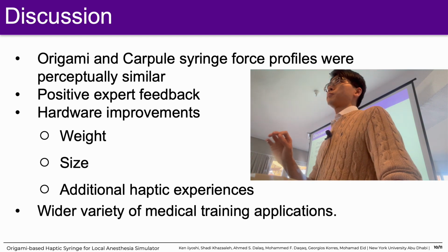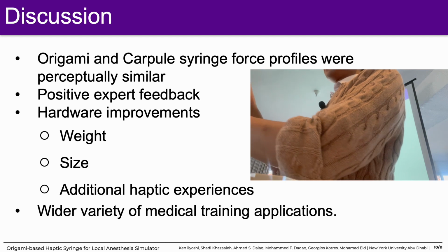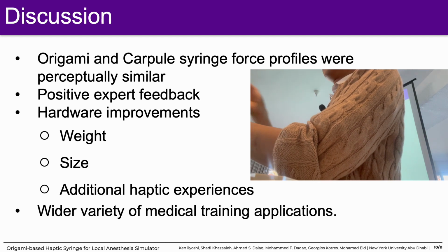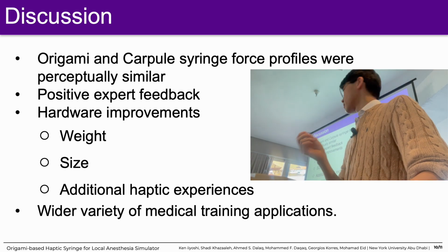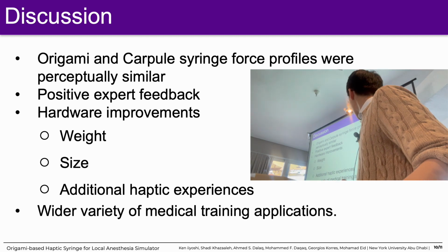For example, for people who have already tried the actual syringe, the syringe can also pull back, and that corresponds to a blood retraction procedure. So we can add haptic sensations like that, and of course extend it to a wider variety of medical training applications.